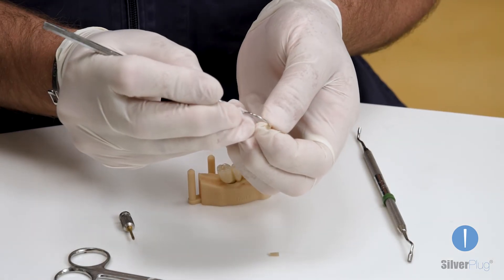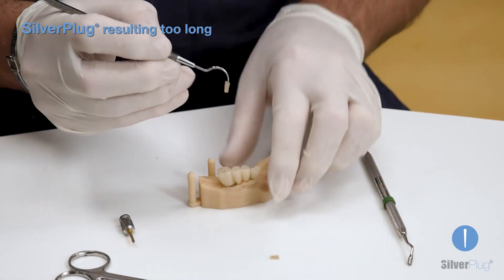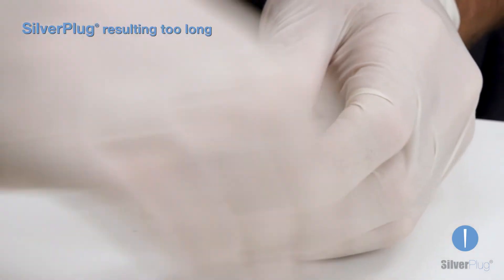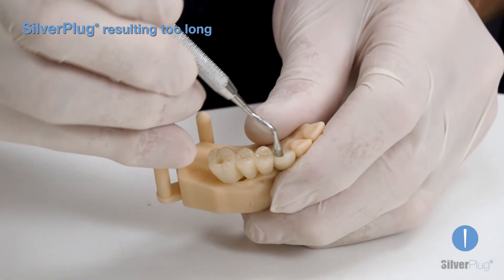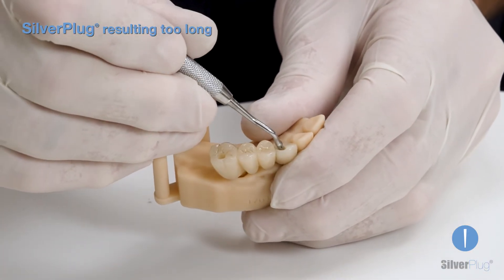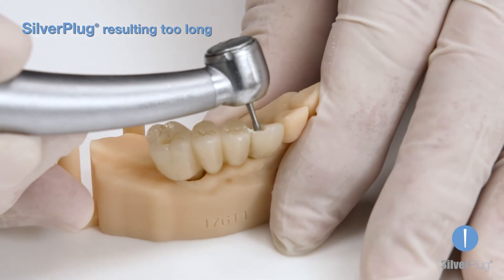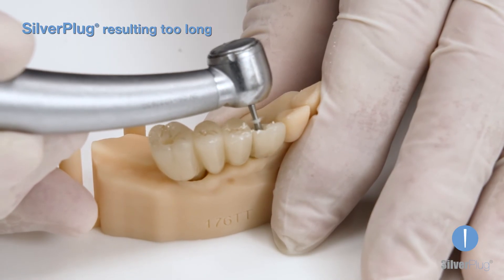After cutting a section of Silverplug and inserting it into the implant tunnel, it might happen to be slightly too long, not leaving enough space for the composite or cement layer. In this case, it is possible to trim part of the Silverplug off with a polishing burr until the desired space is obtained.